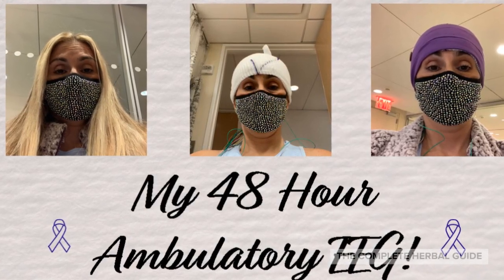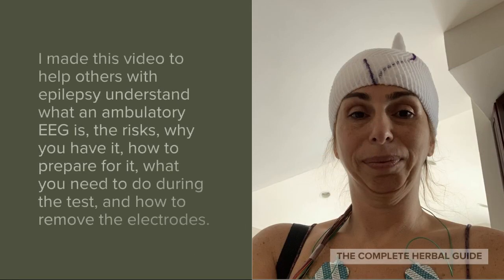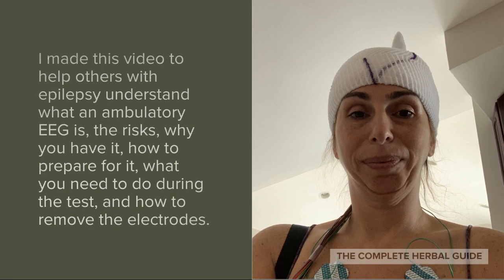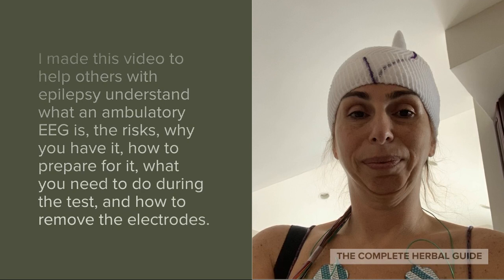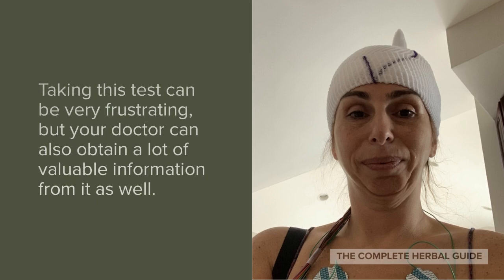My 48-hour ambulatory EEG. I made this video to help others with epilepsy understand what the ambulatory EEG is, the risks, why you have it, how to prepare for it, what you need to do during the test, and how to remove the electrodes. Taking this test can be very frustrating, but your doctor can also obtain a lot of valuable information from it as well.